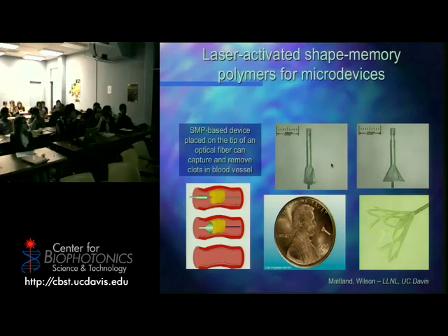And this one, can you think of any problems that might arise with this? Takes too long. Takes too long? That one's not too bad. Well, the good news is when you're going up an artery like this, it goes from large to narrower. So the way you're traveling through the system is you're trying to travel in a direction where you would never be in a situation when you're pulling it back through something narrower. You're hoping that pretty much you've got that relatively contained. Or if you are going through something slightly narrow, it's very minimal.